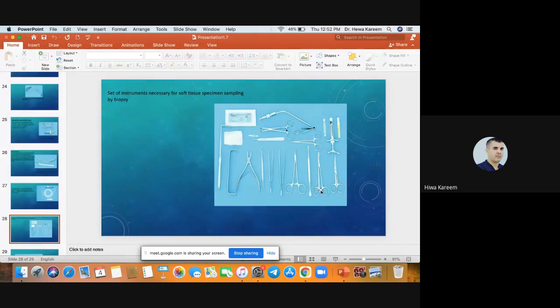For example, sucker, towel clip, blade holder, blade, dental syringe, carpule, covered needle, scissor, sharp end or blade end, and periosteal elevator for elevating the flap, mosquito to stop the bleeding, two types of soft tissue grasping forceps, one end toothed and the other non-toothed.